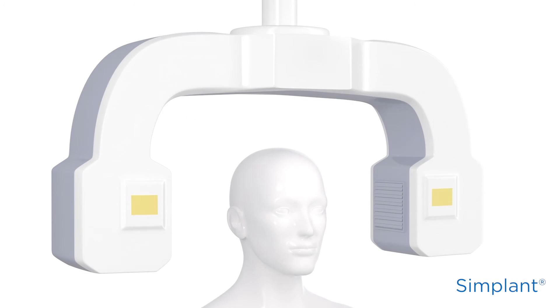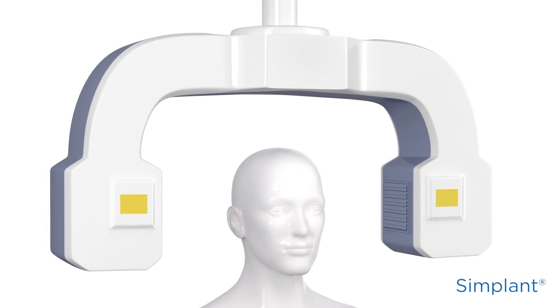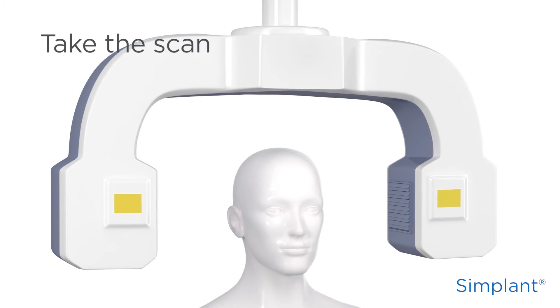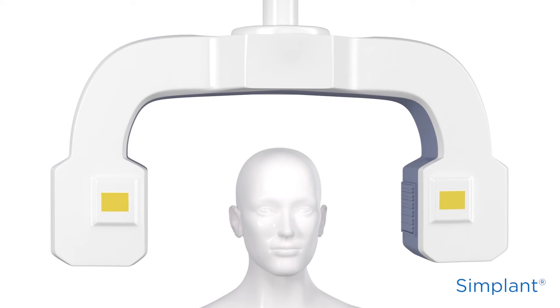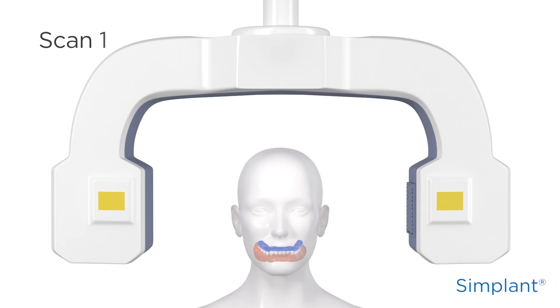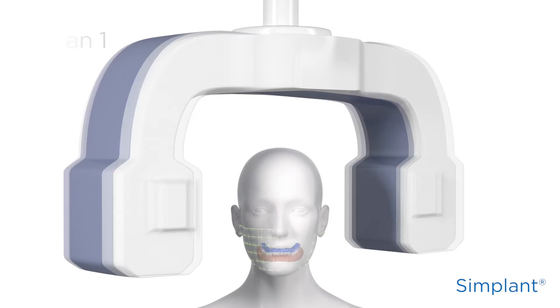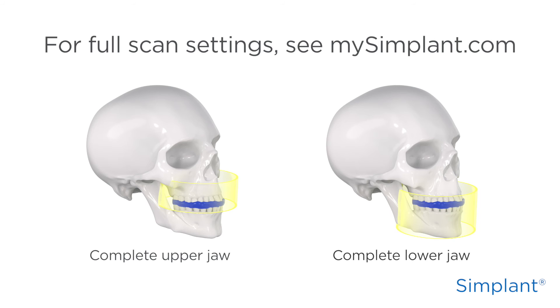Now that you've prepared the scan prosthesis with dual scan markers and the bite index, you can take the scan. The scan will also provide information about the patient's soft tissue and the envisioned prosthetic setup. For the dual scan procedure, you need to make two scans. First, scan the patient wearing the bite index and the scan prosthesis with dual scan markers. The complete upper or lower jaw, including the bite index and scan prosthesis, should be in the field of view.